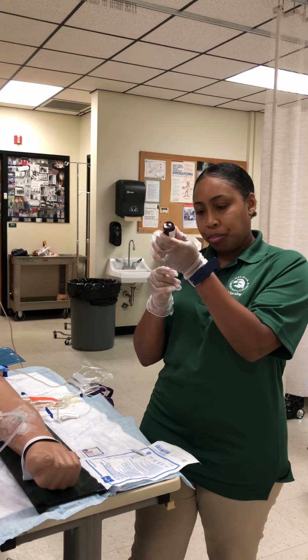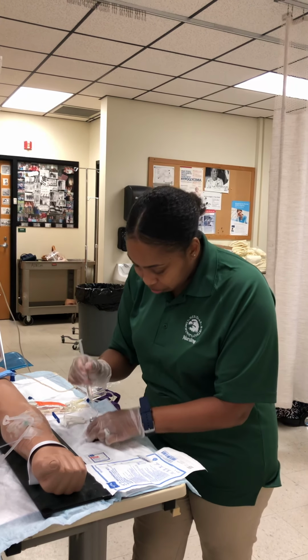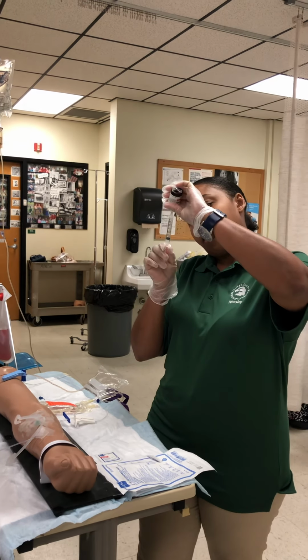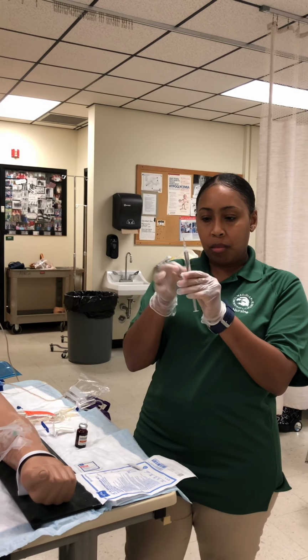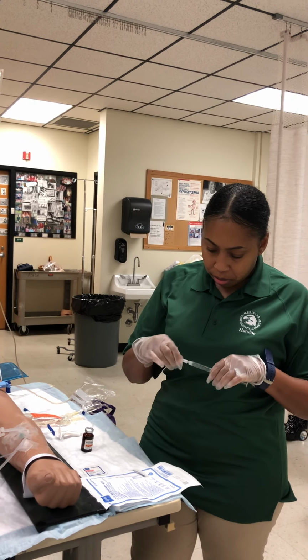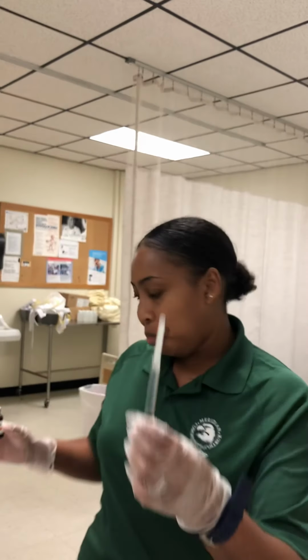All right, 3 milliliters. This is 3 milliliters, and this is furosemide.